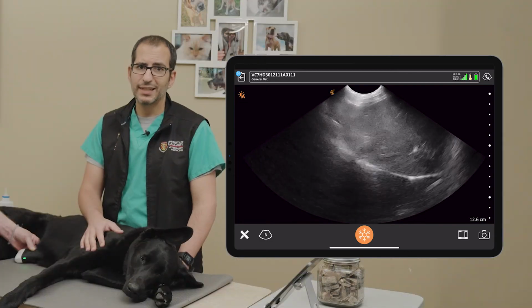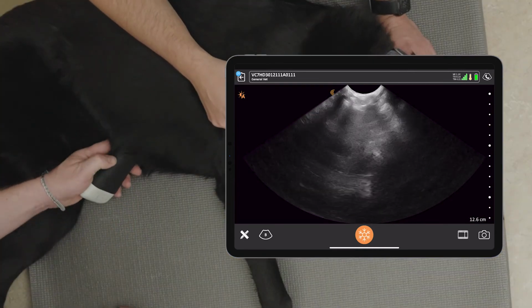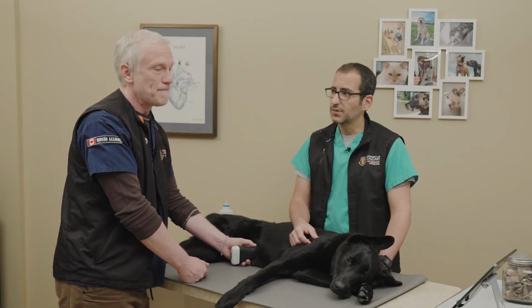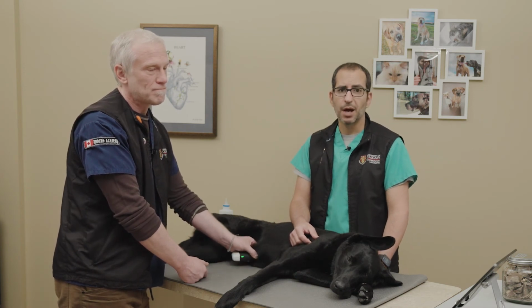I love it, Dr. Boysen, and let's not forget we do all of this in short axis as well. And here we have a big smiley face with the liver on top there. That's how we know we have the entire image, and we can ask the same question. Dr. Boysen, I love it. And that was the subxiphoid site of the abdominal POCUS.